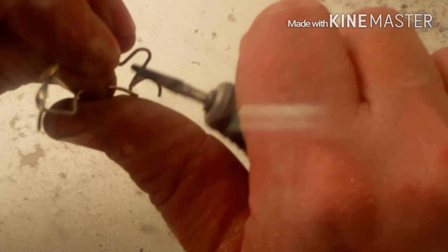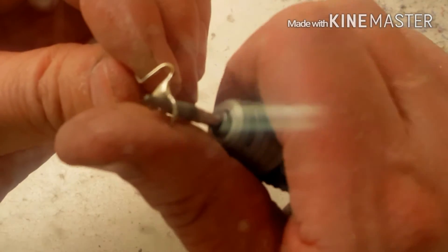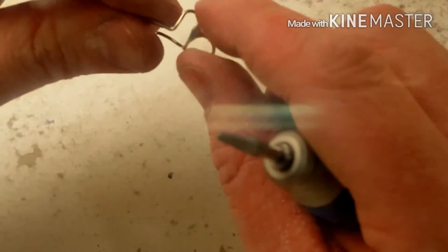And yeah, you'll see that not every burr is equal. Sometimes you've got to learn that the hard way or the expensive way.